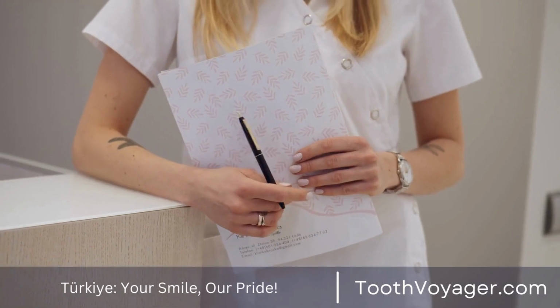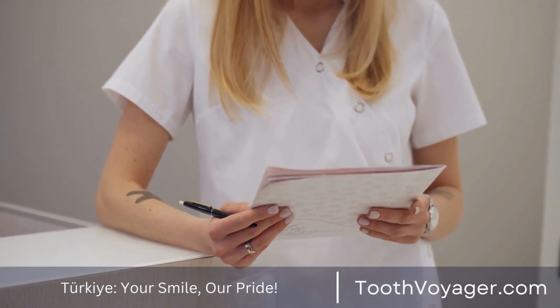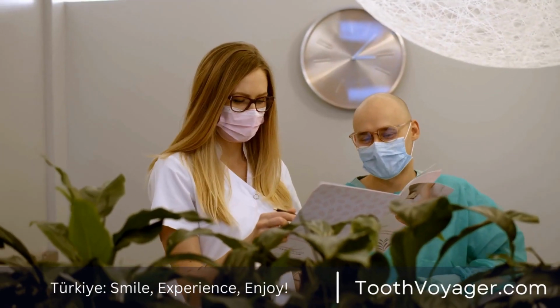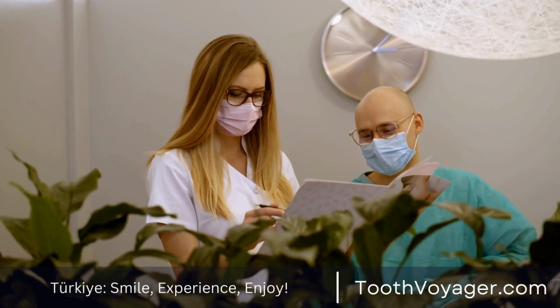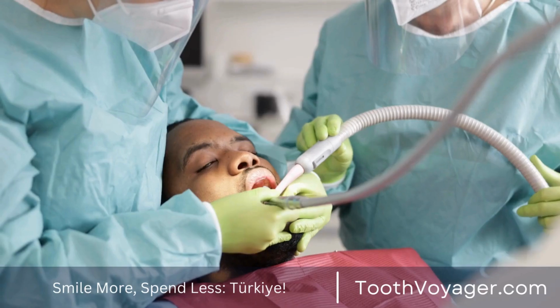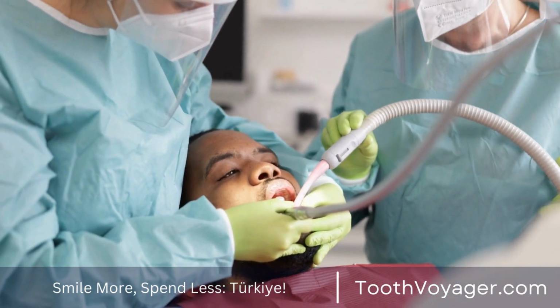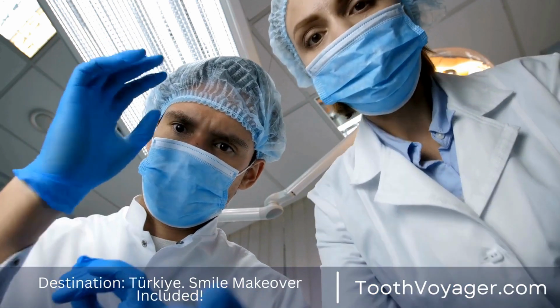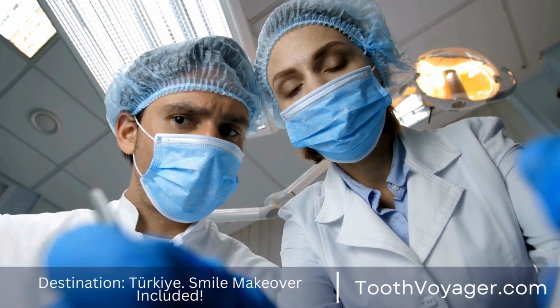One of the biggest benefits of 3D printing for dentistry is its capacity to make highly accurate dental models. Dental models created using traditional techniques usually involved messy material and unreliable results. Dental professionals can create accurate digital images of the patient's gums and teeth with incredible detail. Digital models of the patient can be used to make custom dental crowns and bridges as well as dental implants.